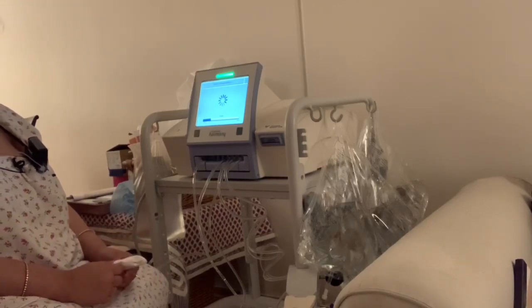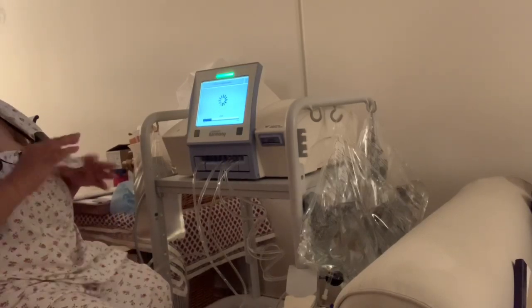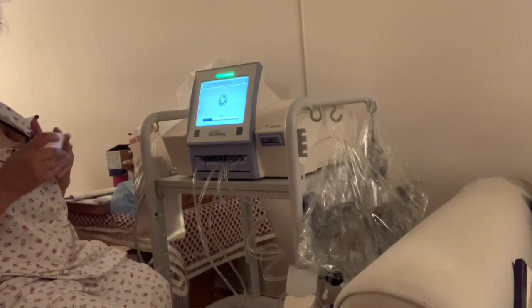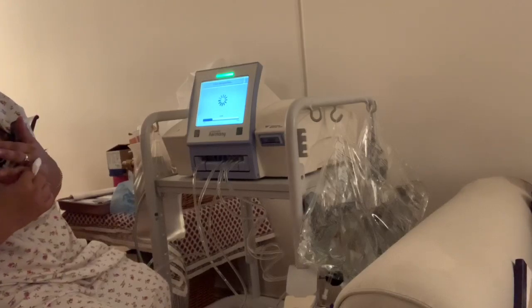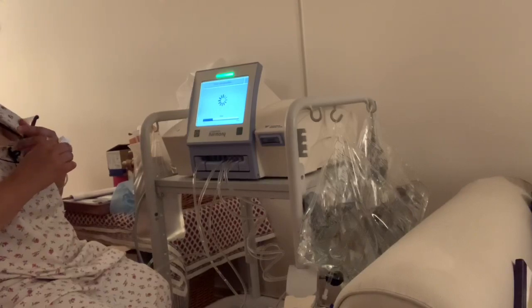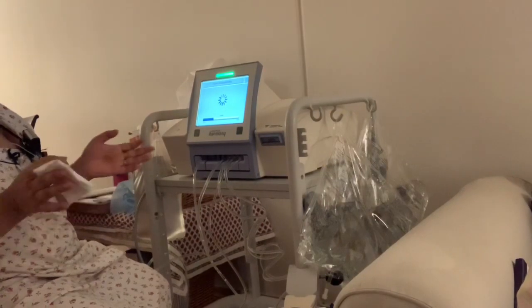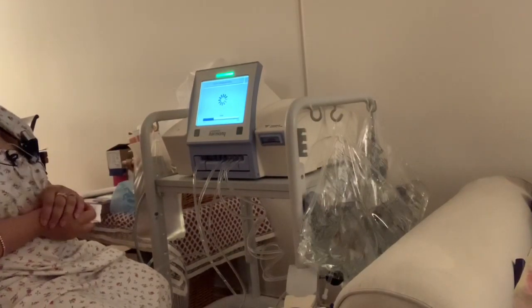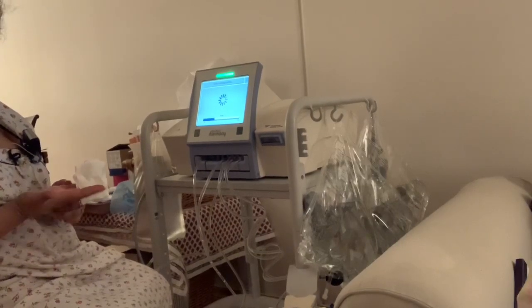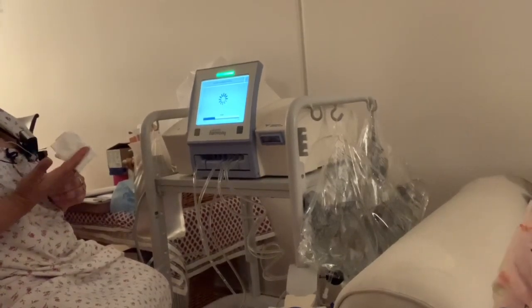This part takes time; you have to be patient. You can't touch anything, so even though I see the mess and want to clear up, I can't — I'm afraid something will slip and fall. What we could do is use an empty open box and just put things directly in there without touching anything.